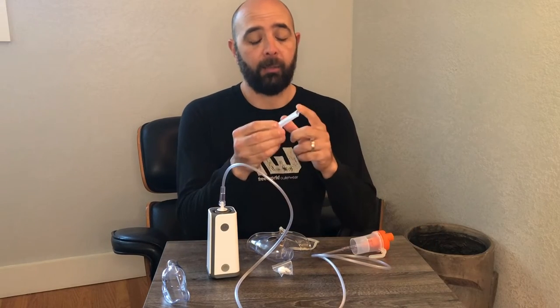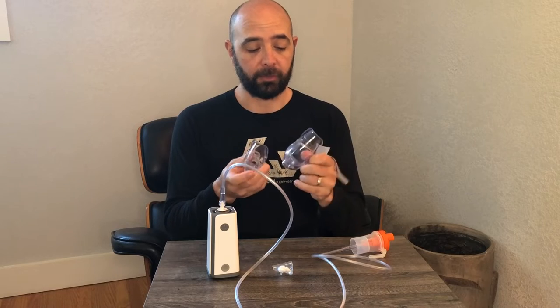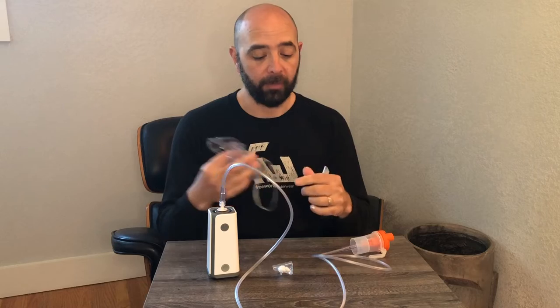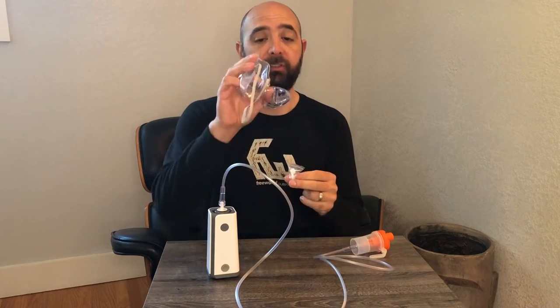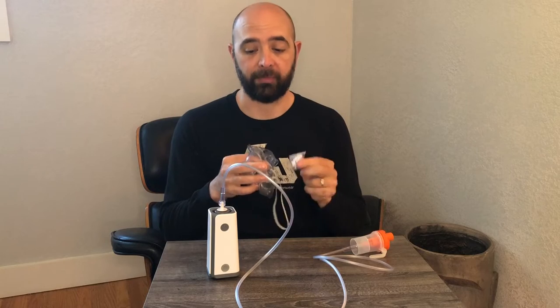There's this one here for inhalation and then there's two different masks if you wanted to breathe it in through your nose as well. Two different sizes for kids and for adults — it does come with an adjustable elastic band you can take off and add to either one. It's really something you can use for the whole family. Make sure you sterilize and wash them, and it comes with a little extra pack of filters to keep everything clean and safe.